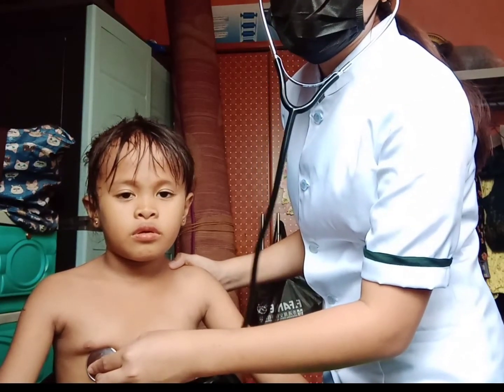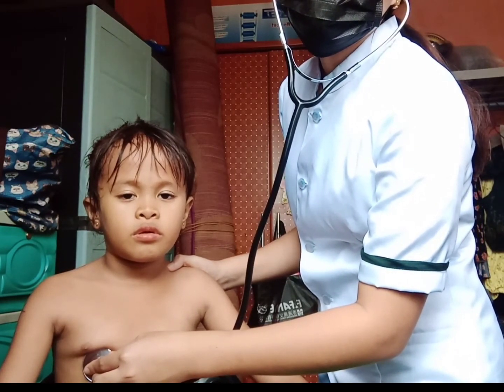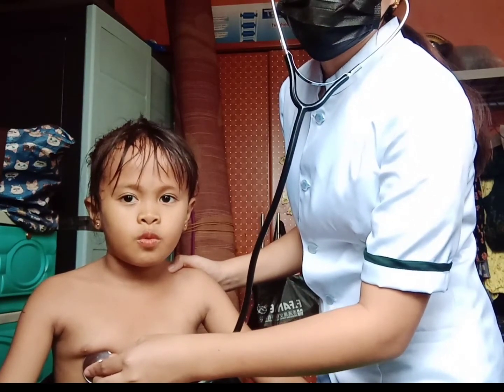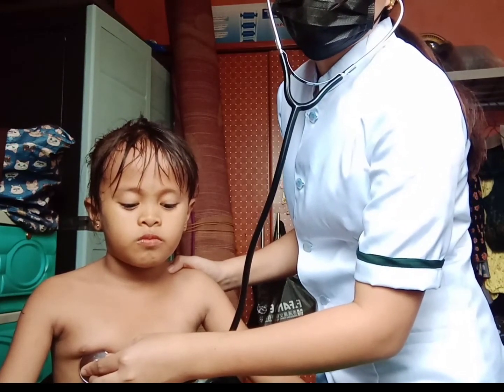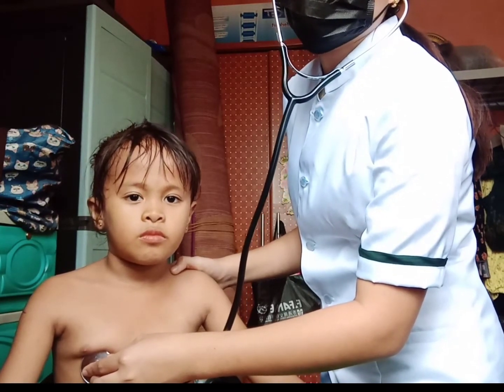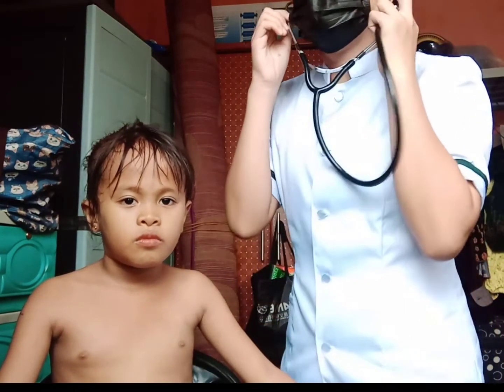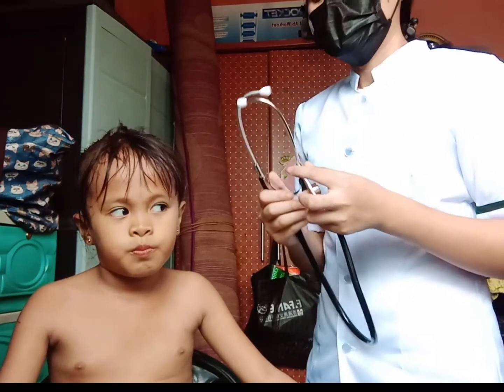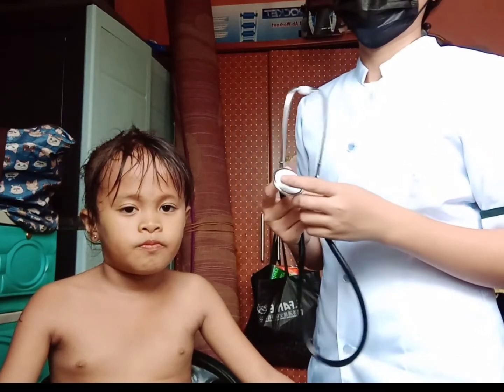So, narinig ko na ang kanyang pulse. So, I heard the S1 and S2 sound or the lub-dub. And I don't hear any murmur sounds. So, the pulse is normal. So, we're going to repeat it. We will auscultate again using the bell of the stethoscope for the low pitch sound.